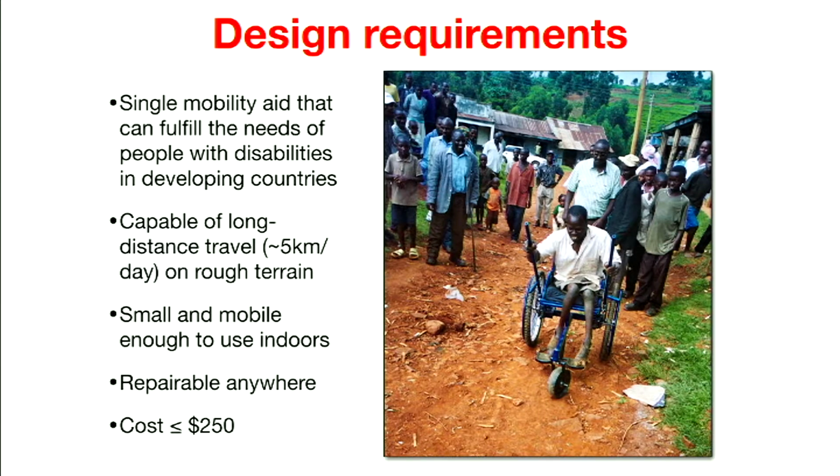I spent a lot of time in country. I researched this situation worldwide. I understood the compelling need for wheelchairs around the world. This set up those core design requirements at the beginning of the project.